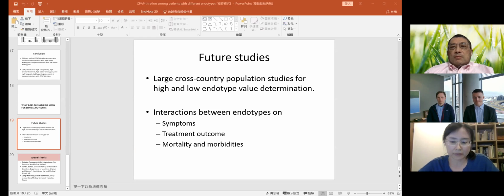And there's a mathematical model to calculate that. And yes, we think that a higher hypopnea fraction, which means that in the total hypopnea and apnea counts, there's a high fraction of hypopnea rather than apnea. Probably, but I wouldn't say it definitely is, but it does suggest a low arousal threshold, because the patient seems to wake up before the respiratory event goes into a total apnea.